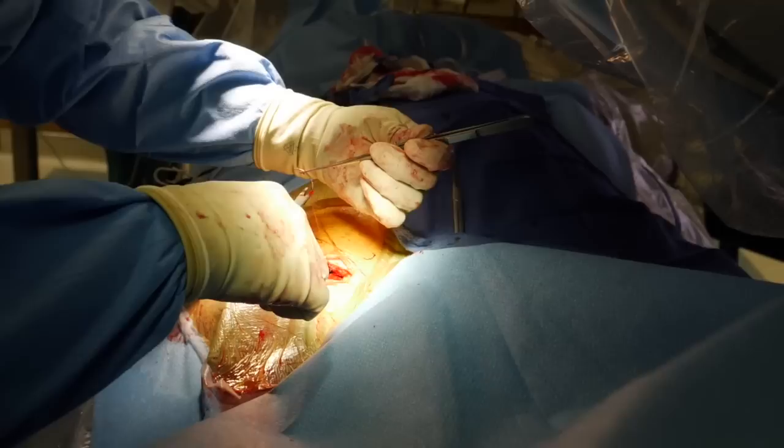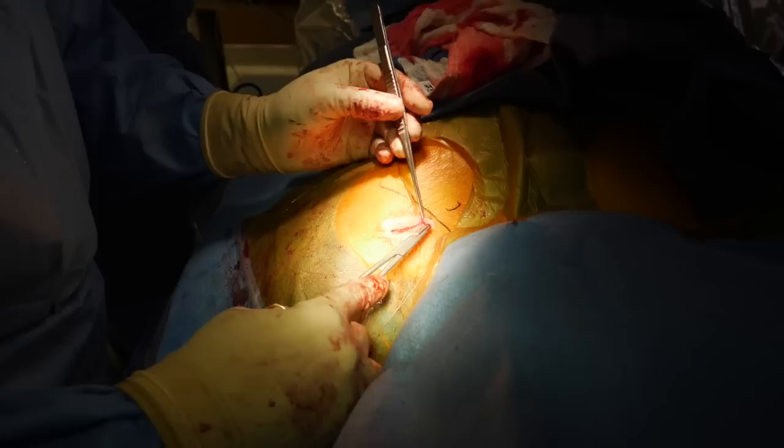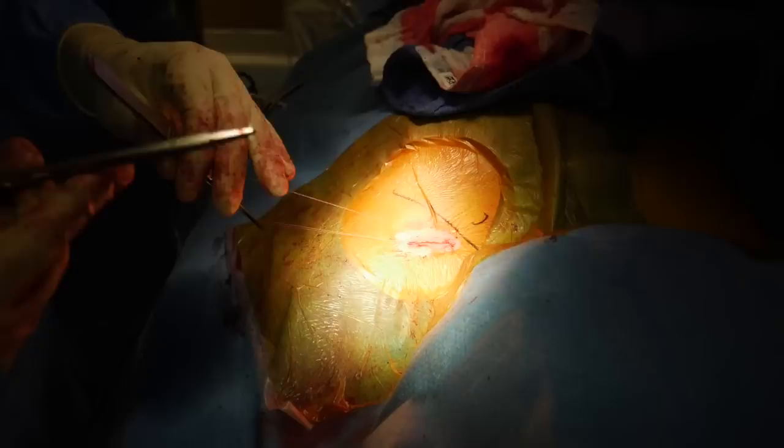Following this, we'll close the skin. We typically use three layers to close the skin — a nice secure pocket, great cosmetic result, excellent structural integrity, and it minimizes the chance of infection. There we are doing the final skin layer to make a very nice incision, which will determine the final cosmetic result and the minimum scarring.